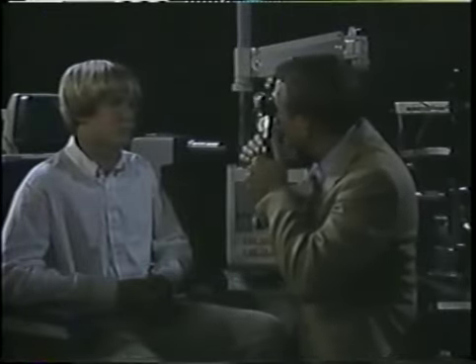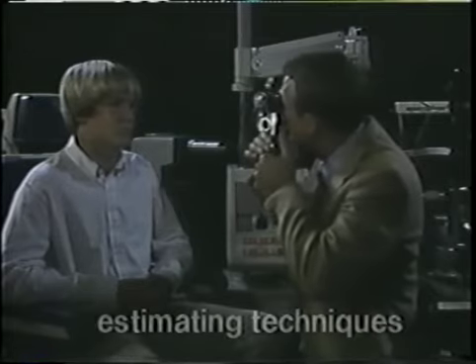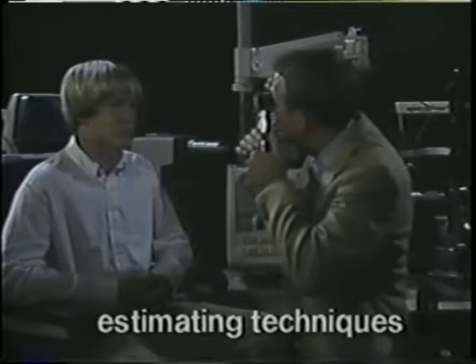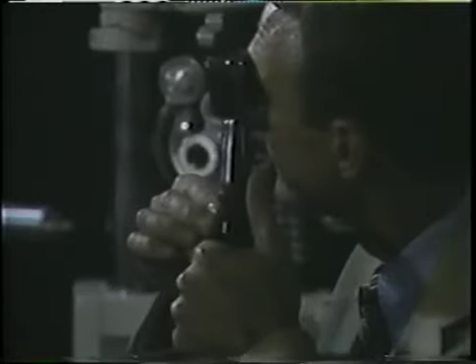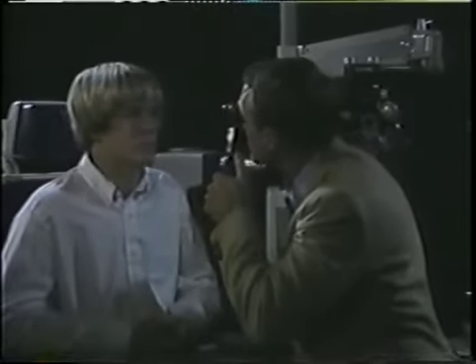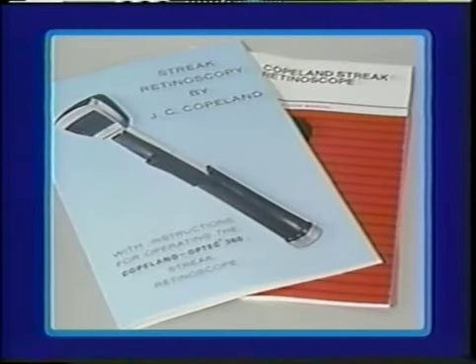If retinoscopists had all the expertise and experience of Jack Copeland, they could use estimating techniques, without lenses, to come very close to the best correction. Copeland used neutralization by moving back and forth, enhancement of the reflex by spiraling, and filament focusing by dropping the sleeve and moving close. All methods to estimate in the various ranges of refractive correction. Instruction manuals for his retinoscopes provide further explanation of these estimating methods.